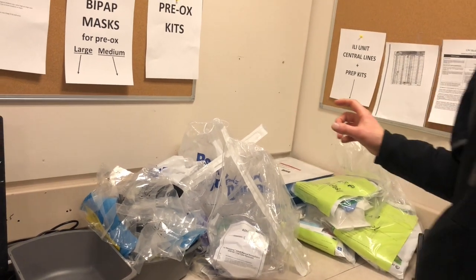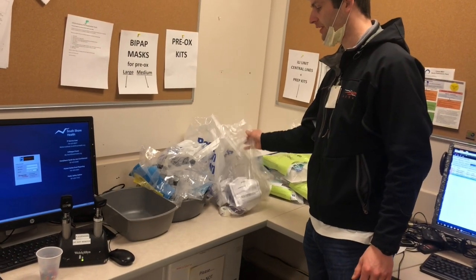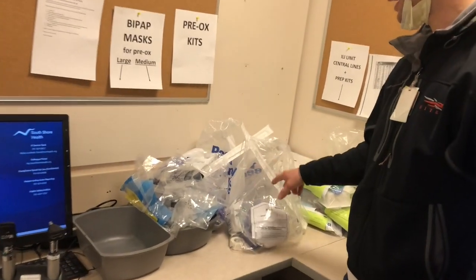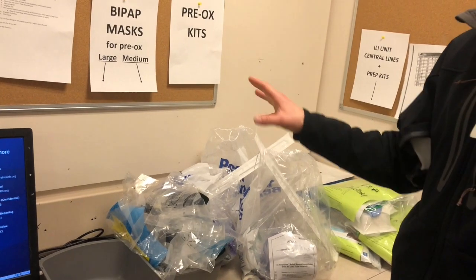So if you have a patient who needs a non-rebreather level of oxygen, you're going to grab one of these pre-oxygenation kits. You will also need to grab a BiPAP mask. The reason why the BiPAP masks are not in the pre-oxygenation kit is because there will be different sizes of patients.